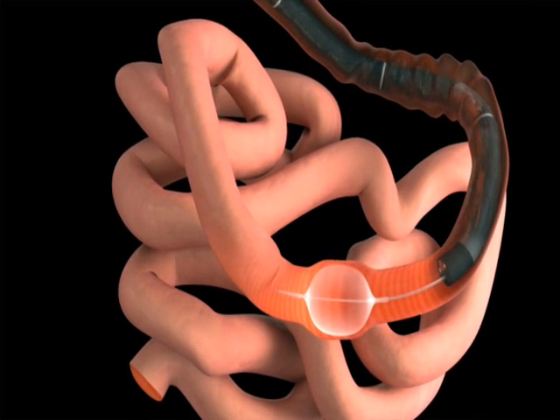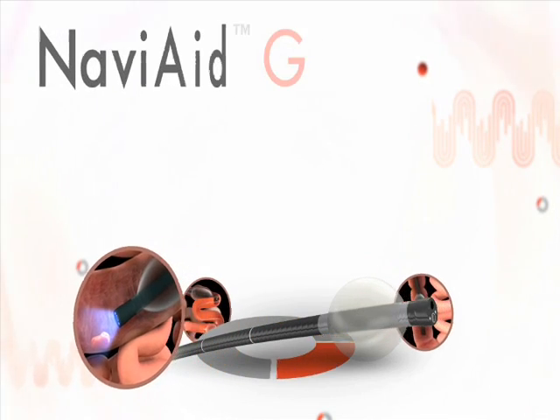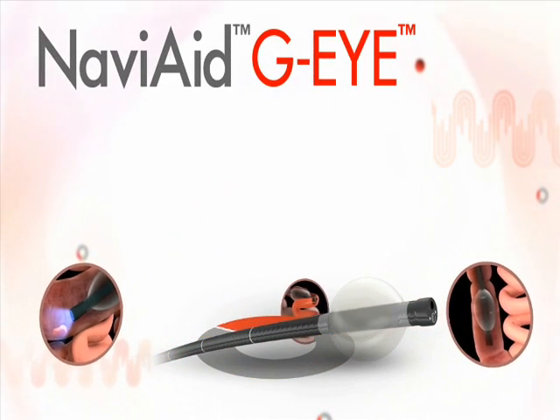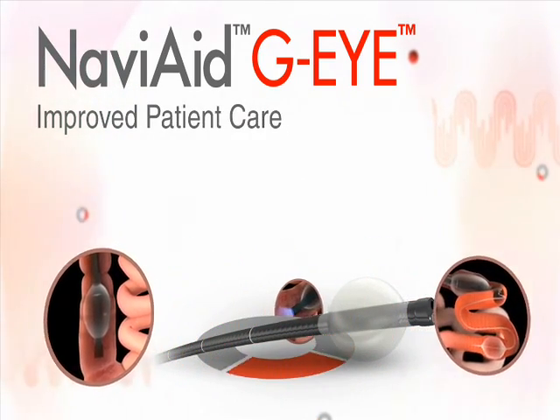Additional advancement steps can be performed as needed. The NaviAid G-EYE provides substantial clinical benefits and improved patient care in a variety of key endoscopy applications.